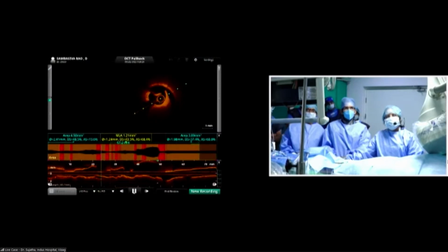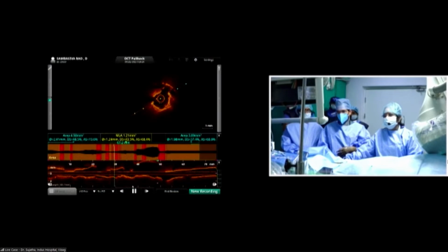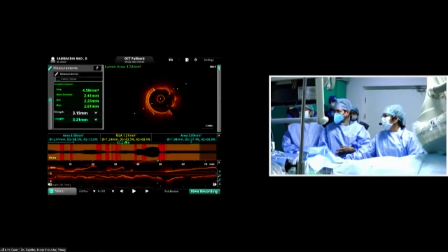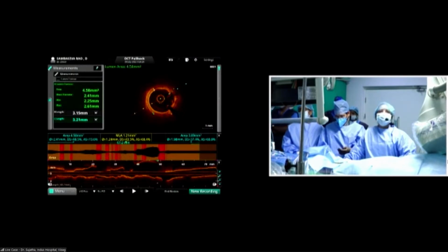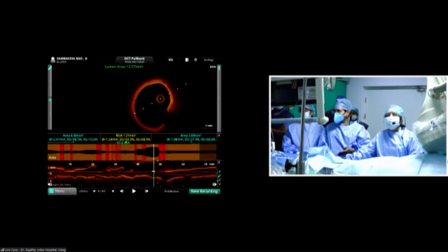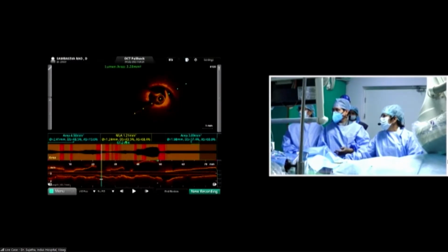So this is the OCT. You can see that the distal vessel was measured. Krishna is with me, he will explain. The distal lumen is around 3.2. Then as we come proximally, you can see, though the calcium score is 4, we made very good dissections with a non-compliant balloon. Can you see the dissections? Can you see the OCT? Yeah, very well, we can see, madam.